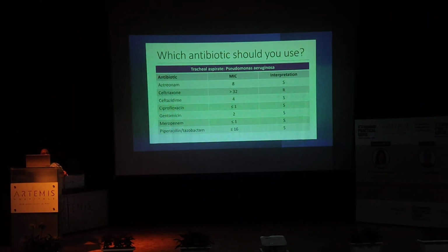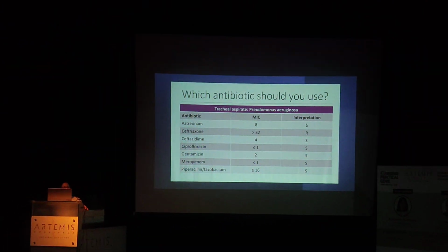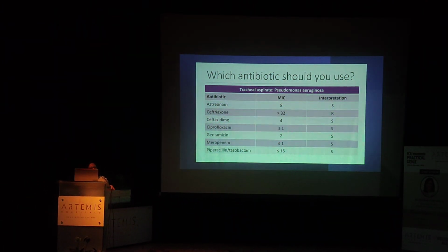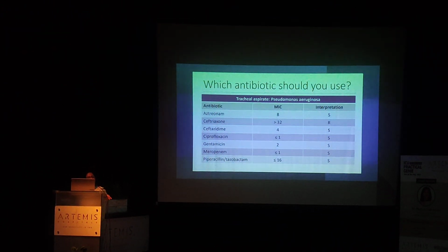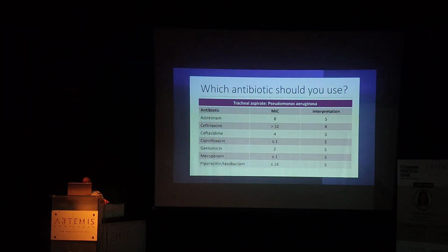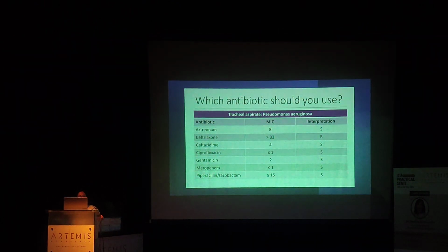This is one example of a tracheal aspirate. It will be a questionnaire. This is a tracheal aspirate which is growing Pseudomonas aeruginosa, right? And as you can see, it is sensitive to many drugs. So my first question is, which antibiotic will you prefer?